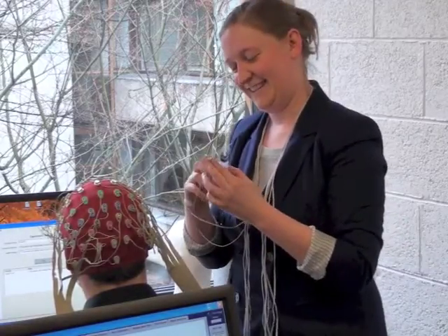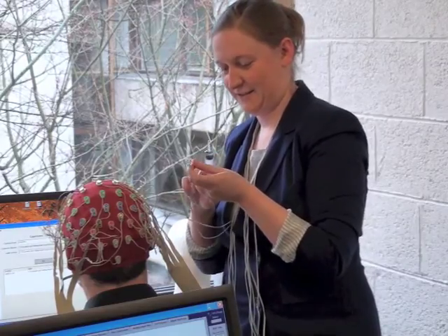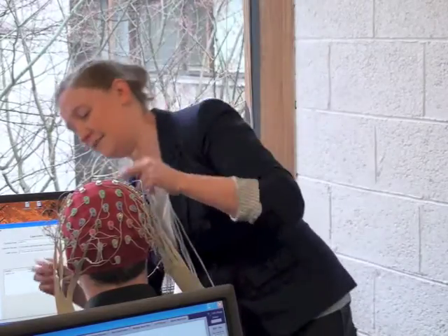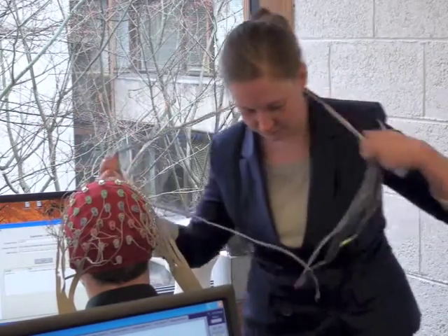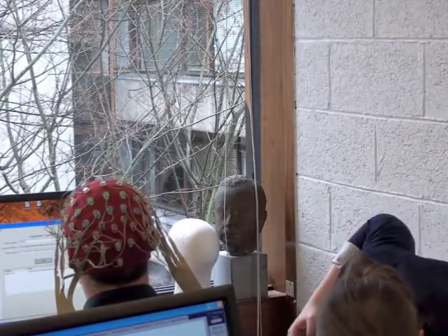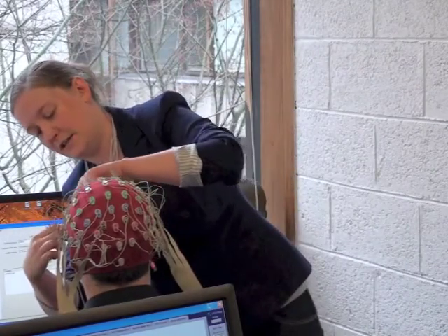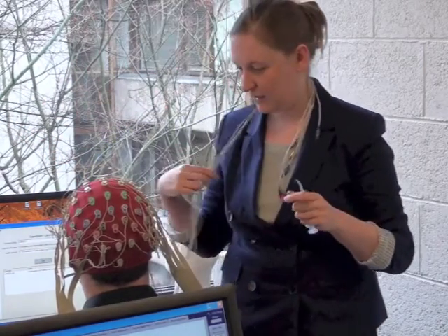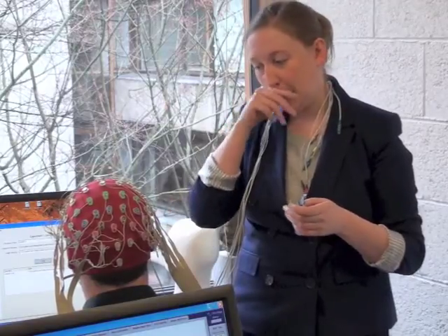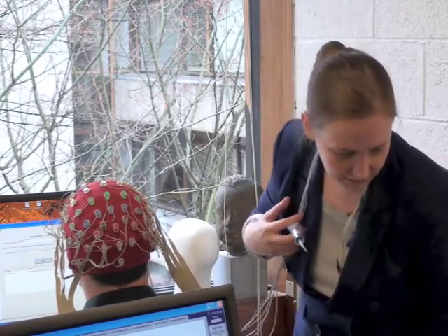Sorry. Okay, so this one goes on the right temple. And this is when the participant starts to feel very uncomfortable because having things stuck on your face isn't very nice. I feel like if I moved my eyebrows, it would make the tape a bit looser. That's alright, there's loads of tape, but thanks. No, but I mean, that's why I feel like I can move less. I feel like I don't want anything to come off. Well, and he's going to have them all over his face, so it is very restrictive. It doesn't feel nice to have them on.